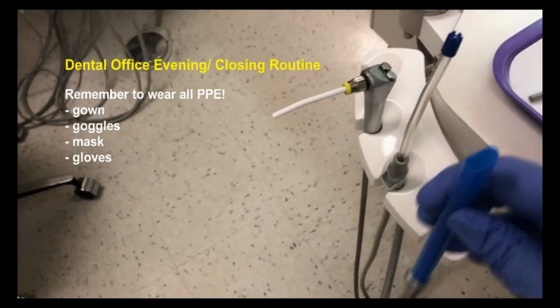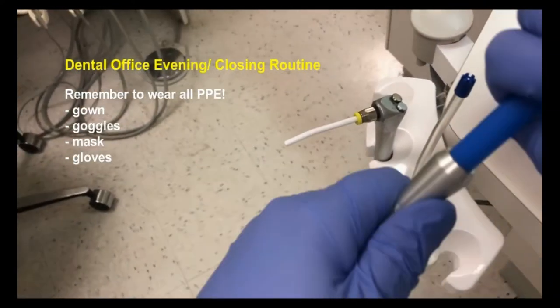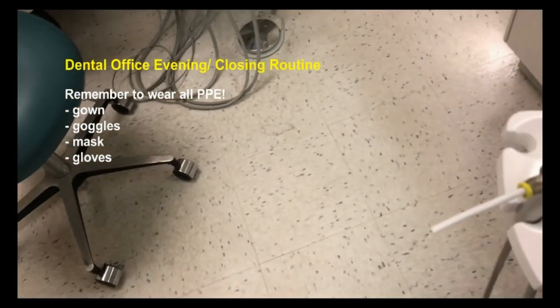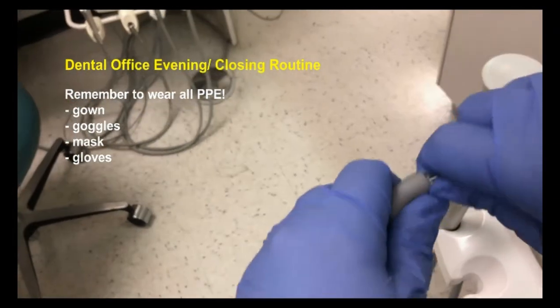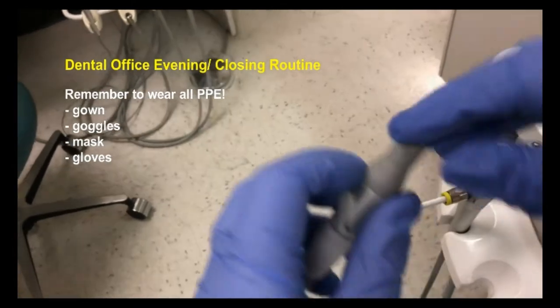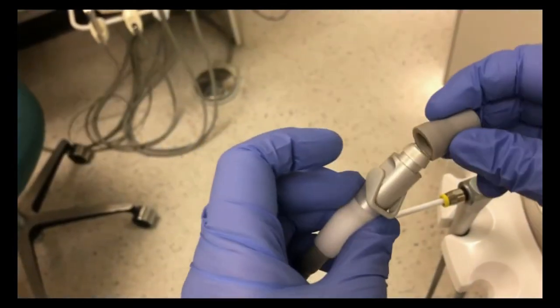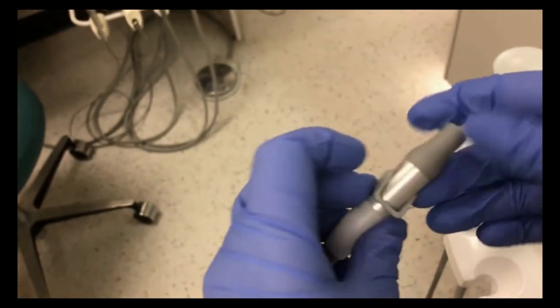During the evening routine you'll need to remove all of your disposable tips. Just pull the tips out of the HVE and the saliva ejector. If the gray silicone tip accidentally comes off when you pull off the saliva ejector, just place it back on the saliva ejector attachment.